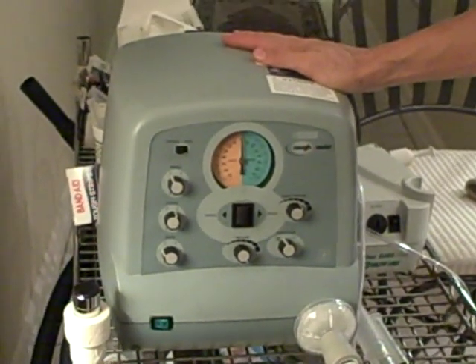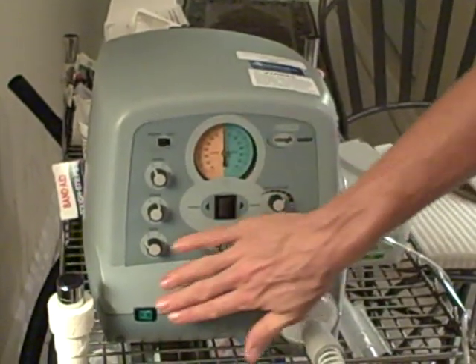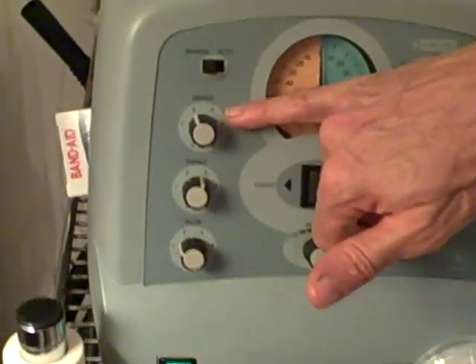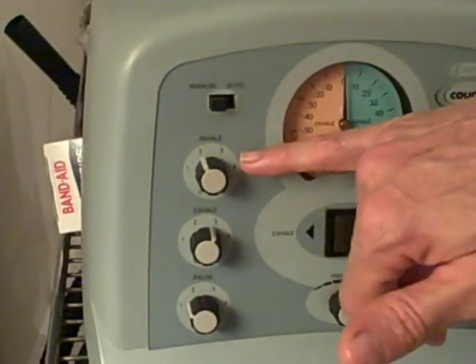This is the Cough Assist. The device is set up. The power button is here. Inhalation buttons are set for Matt.